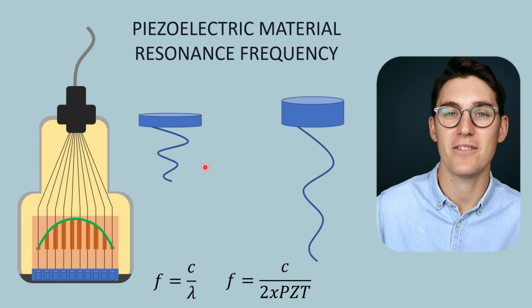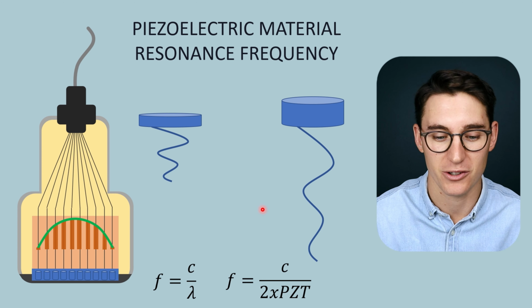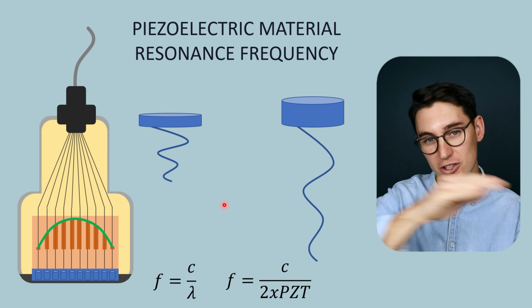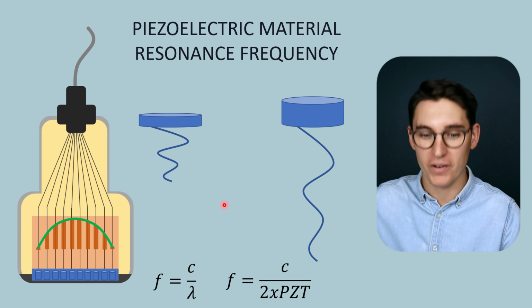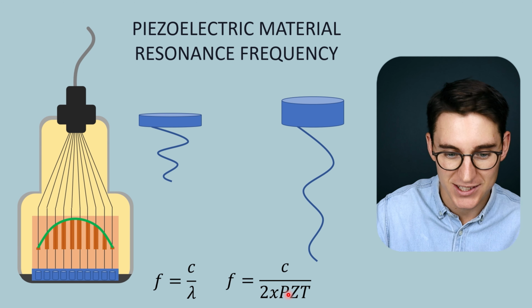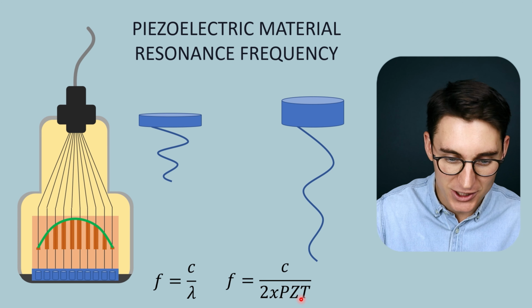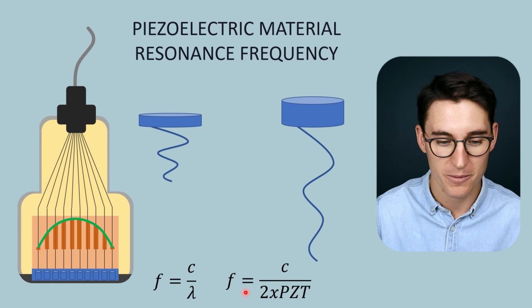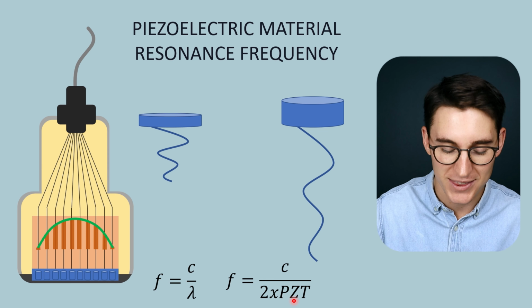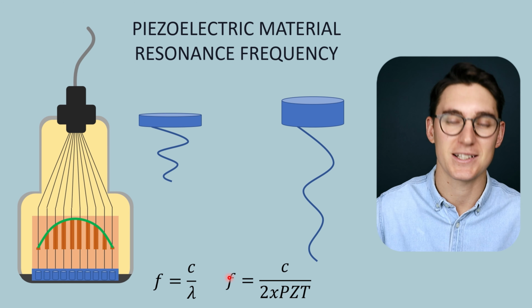What changes is the wavelength. As we saw, we change the length of our guitar string, or we change the thickness of our piezoelectric material, our wavelength would change. And we saw that the thickness of our material, or the guitar string's length, made up half of a wavelength. The same is true here. We can use the piezoelectric material's thickness and times it by 2 to get the wavelength of the wave that is created here. The thickness of our material is half the wavelength. So in order to get this wavelength here for our formula to calculate our frequency, we can take the thickness of our crystal, times it by 2, and use that value to calculate our frequency.